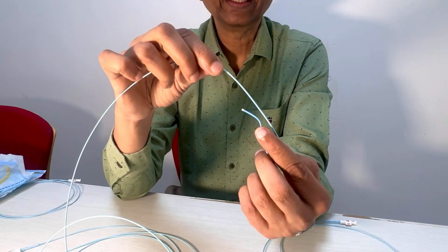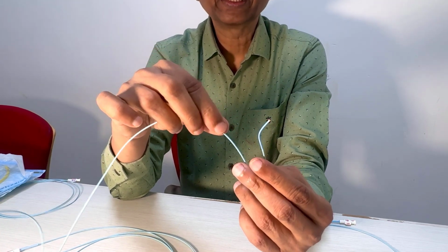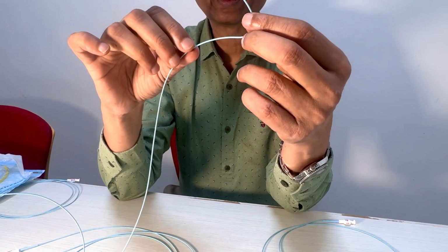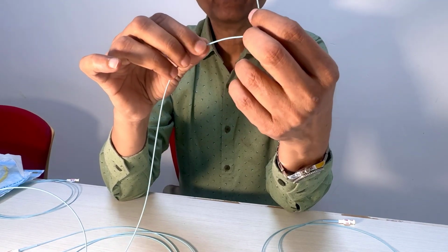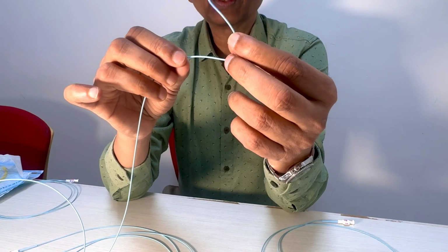And you push it down. And now you've got to straighten this catheter sometimes and use a J wire to open this up. And then you enter that, right? Like I said, it's difficult to go distal. Sometimes you can, but typically what we would do is we would take this catheter, engage the vessel, take a roadmap, take an exchange wire, go into the external carotid artery, and then take a simpler catheter to change it. But once in a way, if the wire gets a very good purchase, you may be able to straighten this catheter and push it, but it's not always possible. So this is a Sim 1, Sim 2, and Sim 3.